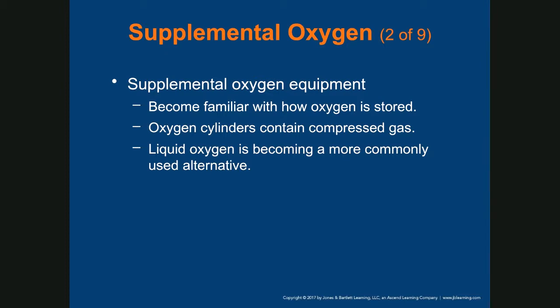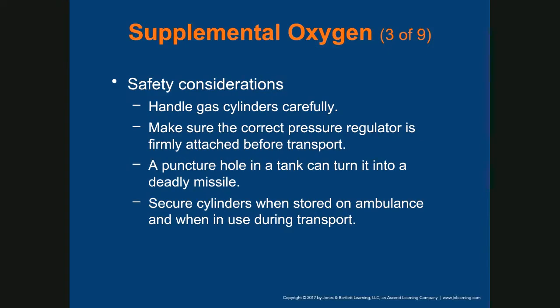Supplemental oxygen equipment: become familiar with how oxygen is stored. Oxygen cylinders contain compressed gas, and that gas is under high pressure. Liquid oxygen is becoming a more commonly used alternative. You're not going to see that much in field EMS, right? Safety consideration: handle gas cylinders carefully.